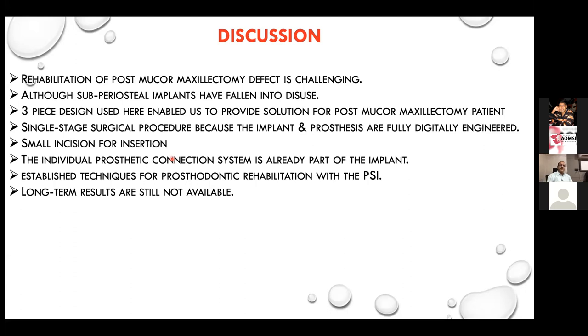We had a problem with the screw fractures in certain cases because in the initial cases, the diameter of the screw which was given and the threading was almost equal. So while placing the screw, we had three or four screw head fractures. Two patients had prosthetic loosening because they were bruxers, and one patient broke the prosthetic two times because of the clenching habit, and ultimately we had to replace it with ceramic.